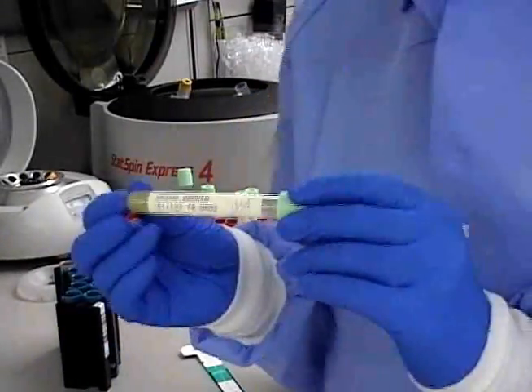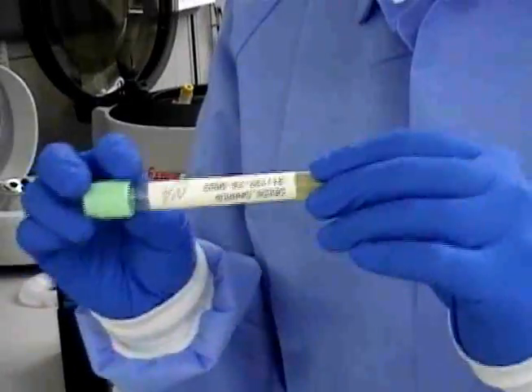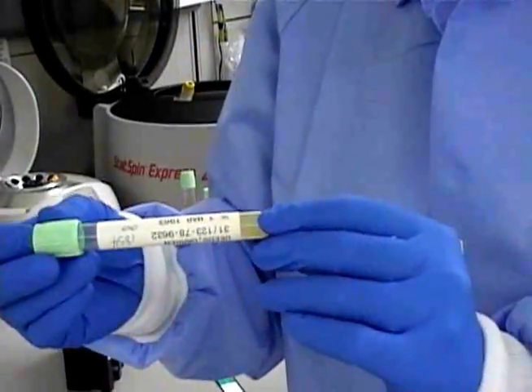This one right here might look correct, but we read everything like this. When we put it in, it's upside down. Also causes a delay in testing.